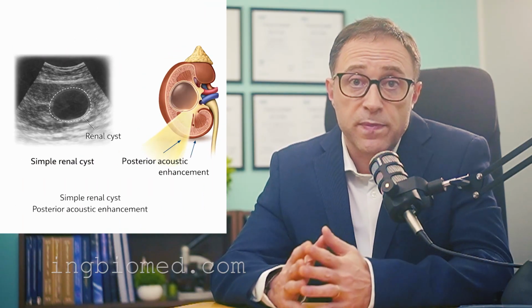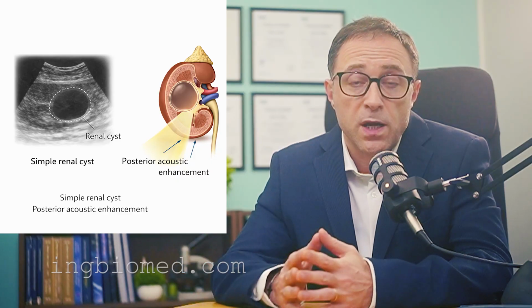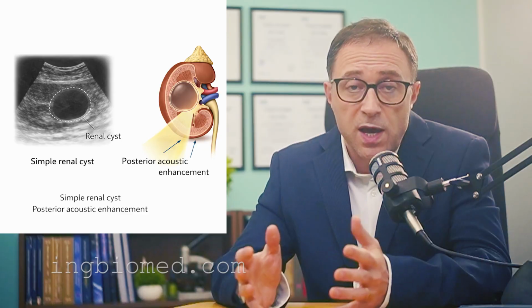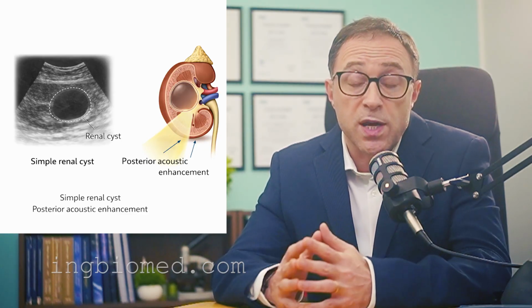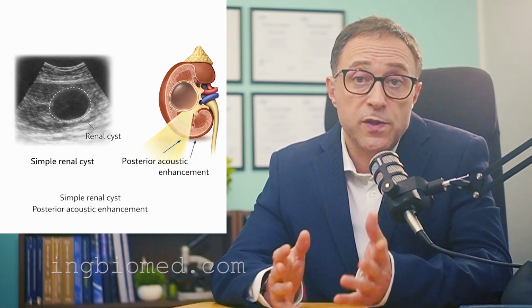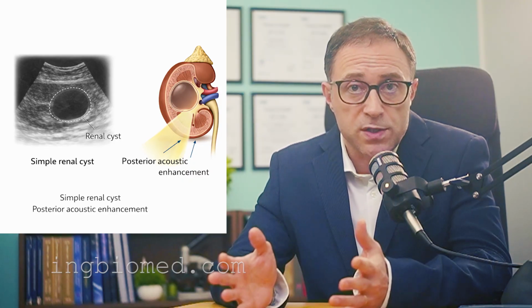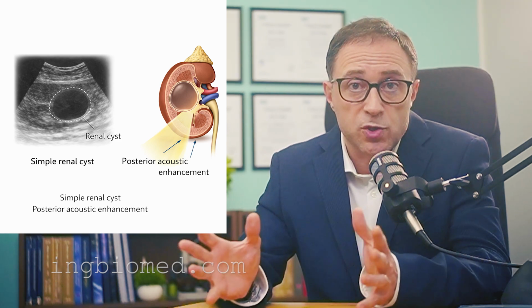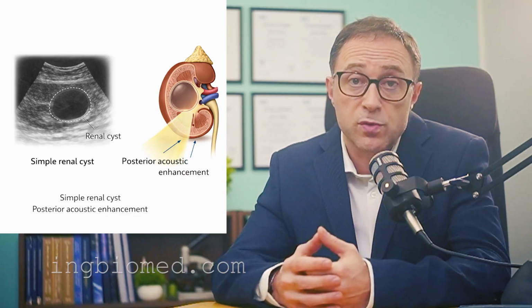Renal cysts are extremely common, especially with advancing age. A simple cyst is anechoic, round or oval, with thin regular walls and posterior acoustic enhancement. This feature allows confident benign diagnosis. However, when internal echoes, septation, or mural nodules are present, further evaluation is required.